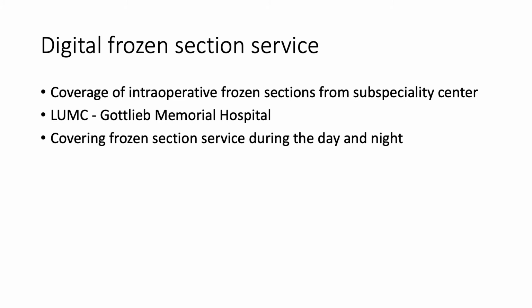Another important application of digital pathology in daily clinical practice is intraoperative consultation, also known as frozen section. By using WSI, you can do intraoperative consultation remotely, which may have an important impact on patient care in remote practices and during night surgeries. I had a few cases of intraoperative consultation during the night. Driving to the hospital would take me an hour, especially during winter time. This would cause a patient waiting under anesthesia for diagnosis for an hour. With digital pathology, I was able to evaluate the frozen section in minutes and report the diagnosis to the surgeon.